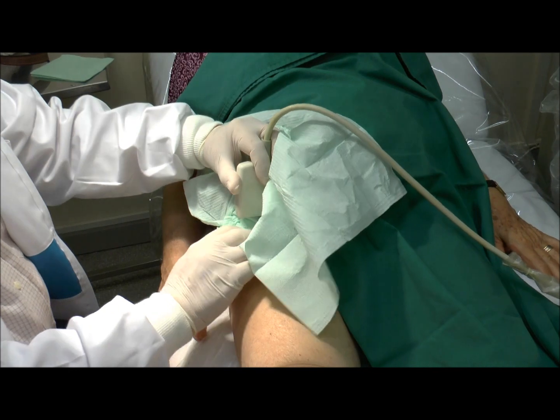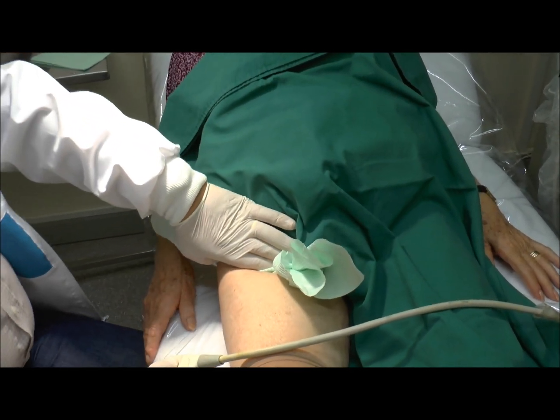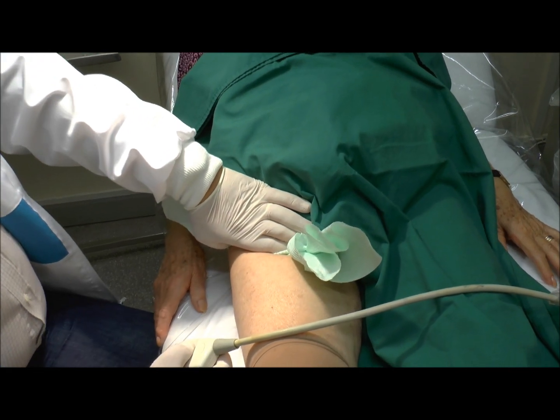And this is the end of the procedure. We are quite far from the vessels. We'll just keep a bit of pressure for a minute or so.